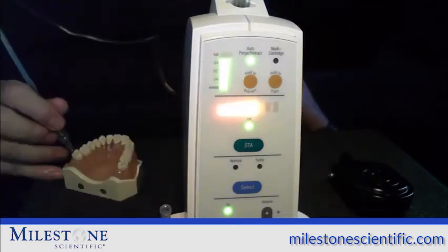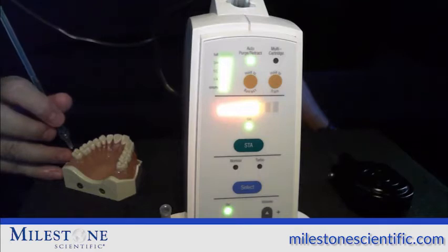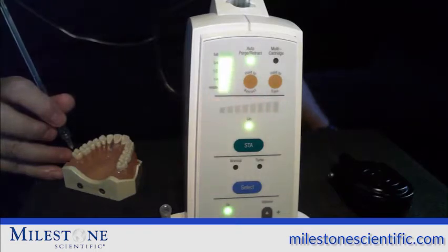When you have arrived at the proper spot, the instrument will start to give you lights and sounds. These lights go from red to yellow and then to green. You do not need to get to green in order to have perfect anesthesia. So when you hear the lights come on, hold the needle in place and do not put pressure on the needle.